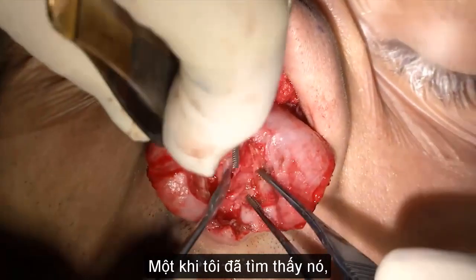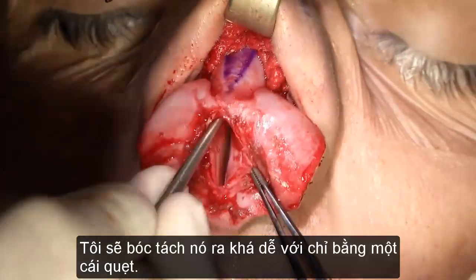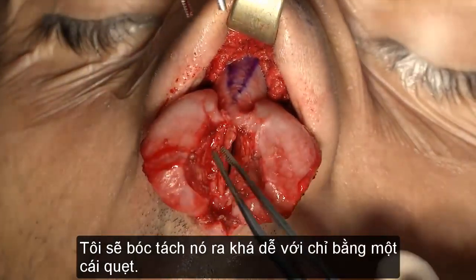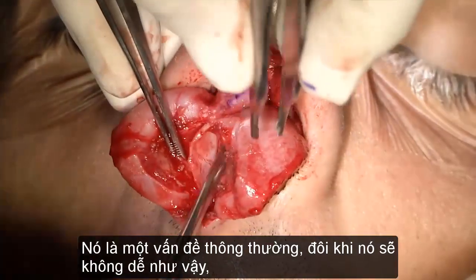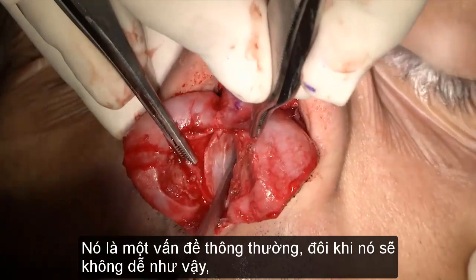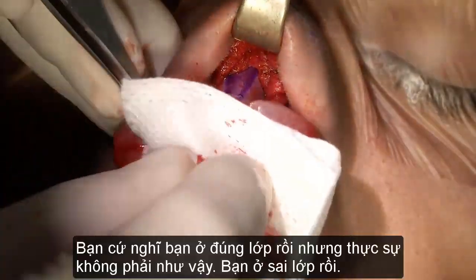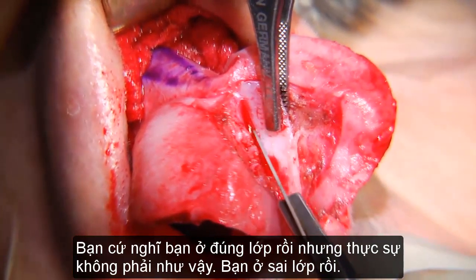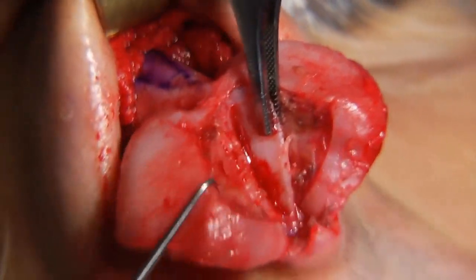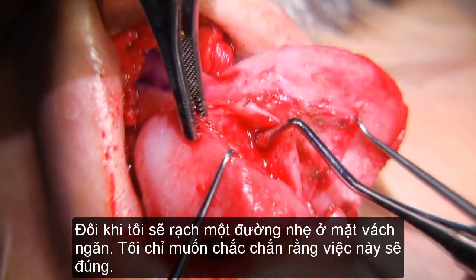So once I have identified it, it's an easy matter of taking down this in a single sweep. Yeah, it's a usual problem. Sometimes this is not always easy. Sometimes this plane is a little bit tricky. You think you are on the right plane, as you all know, and then you are not on the right plane. Sometimes I lightly score. I just want to make sure this thing is correct.